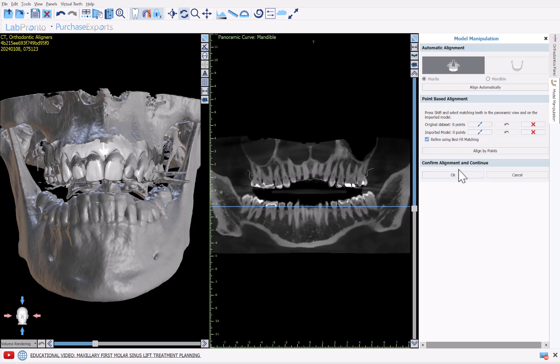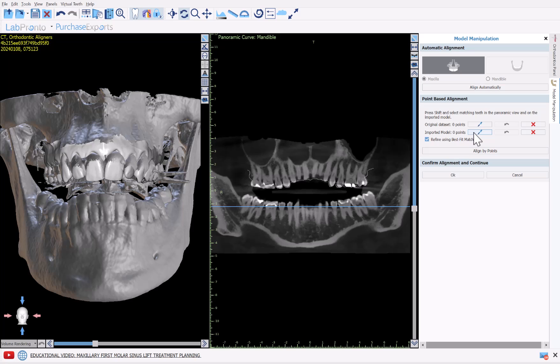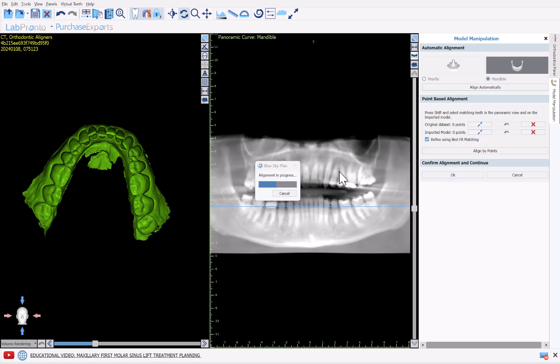We do have the option that if for whatever reason alignment does not work completely automatically, then you can use points by identifying points on each scan and then doing the alignment. But the alignment should be working almost in every case automatically. And if it doesn't, then please do send us the case as well so that we could continue to improve.